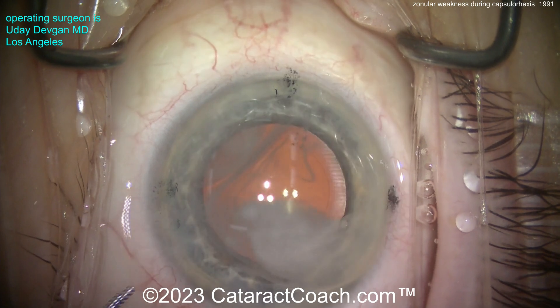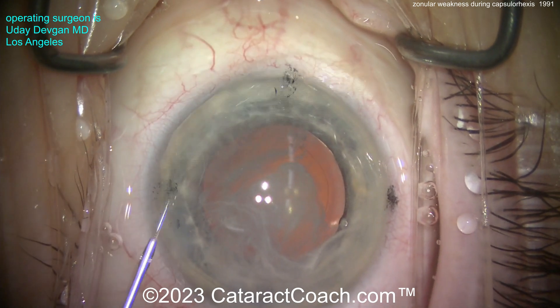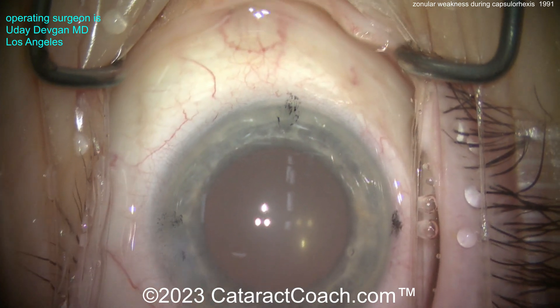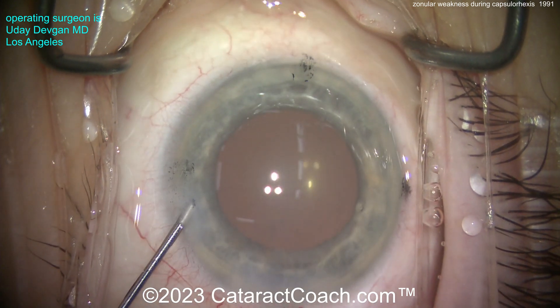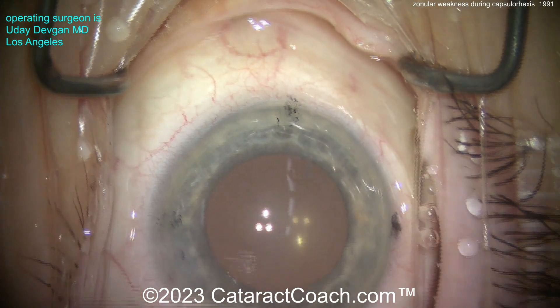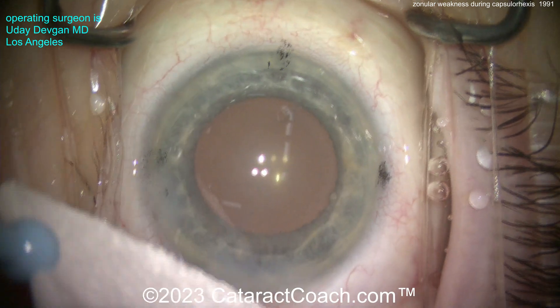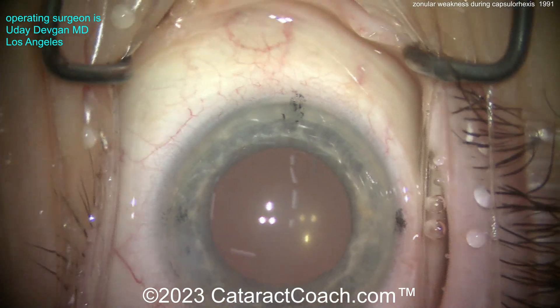Just to make sure there's no late dislocation. A little preservative-free Triamcinolone to help quell any inflammation post-op. Seal that up with some BSS, and then a small aliquot of Moxifloxacin for antibiotic endophthalmitis prophylaxis. End of the case — all the incisions look great. So if you see that wrinkling of the anterior lens capsule during your rhexis creation, now you know what it means and what to do.